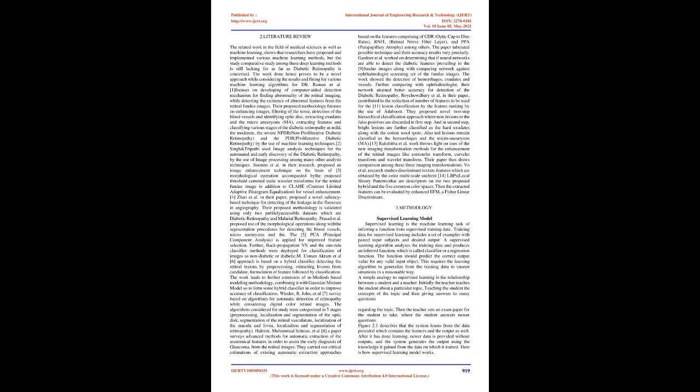2. Literature review. The related work in the field of medical sciences as well as machine learning shows that researchers have proposed and implemented various machine learning methods, but the comparative study among these deep learning methods is still lacking as far as diabetic retinopathy is concerned. The work done hence proves to be a novel approach while considering the results and findings for various machine learning algorithms for DR. Raman et al. focus on developing a computer-aided detection mechanism for finding abnormality of the retinal imaging, while detecting the existence of abnormal features from the retinal fundus images.